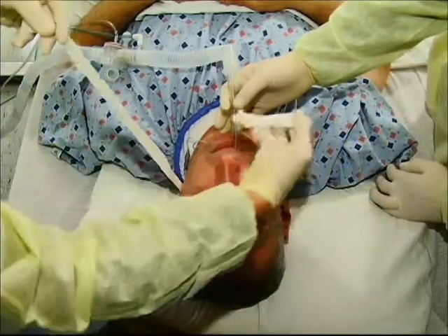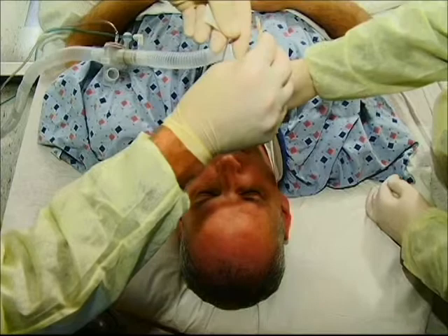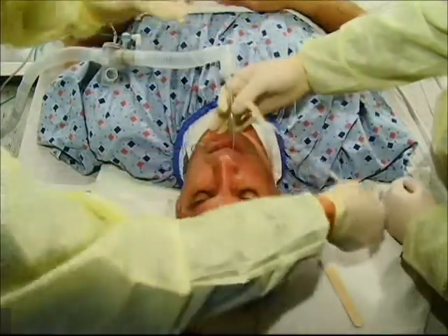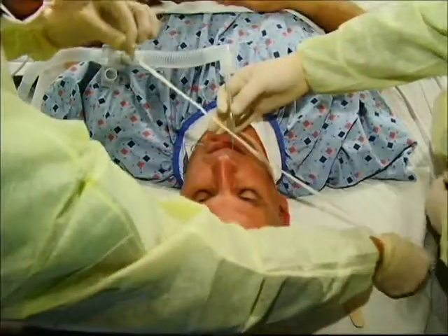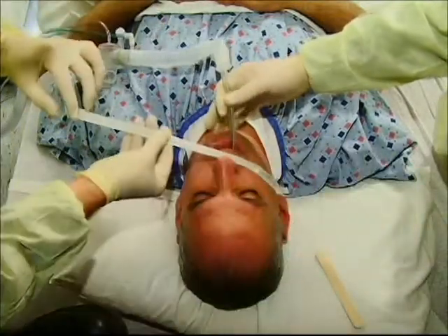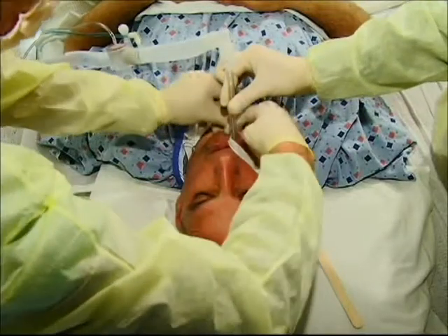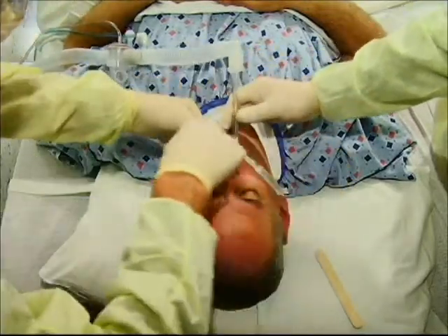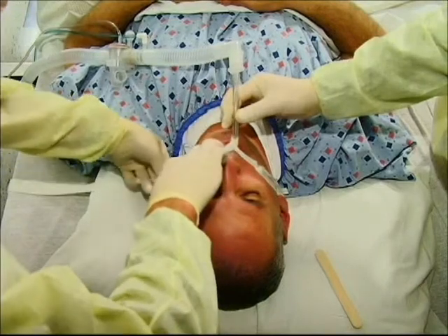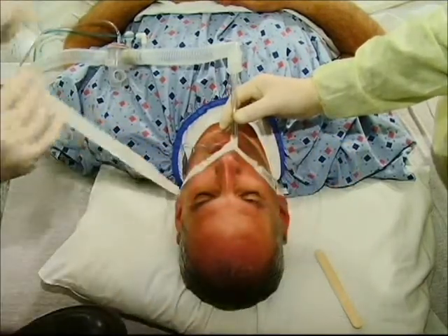Start the taping procedure on the side of the mouth where the endotracheal tube is placed. Using the original one-inch tear, create a longer tear in the tape. Select one strip of tape created by the tear and wrap it around the base of the endotracheal tube at the lips, being very careful to avoid modifying the depth of the tube. After wrapping the tape around the endotracheal tube one to two times, adhere the remainder of the tape along the upper lip and cheek.